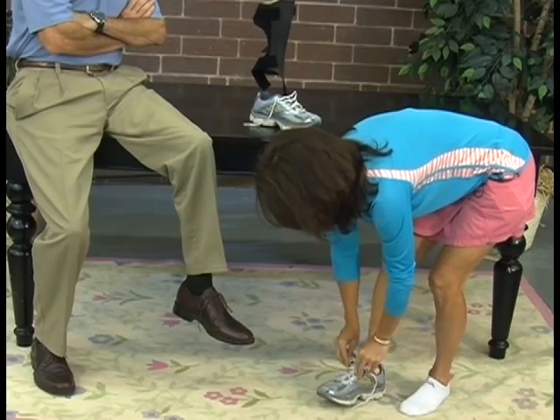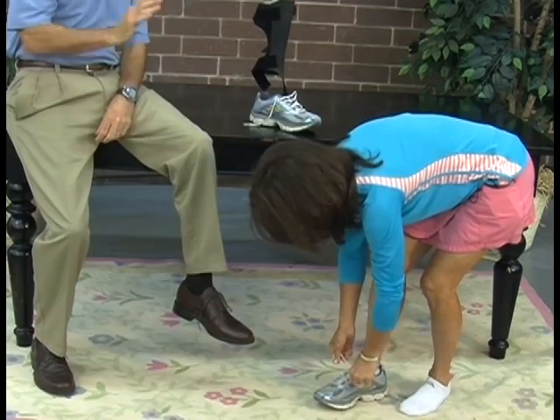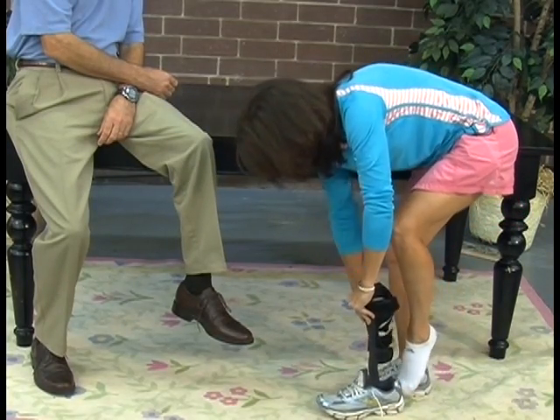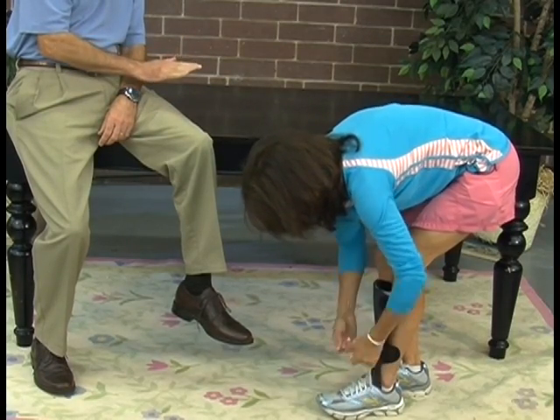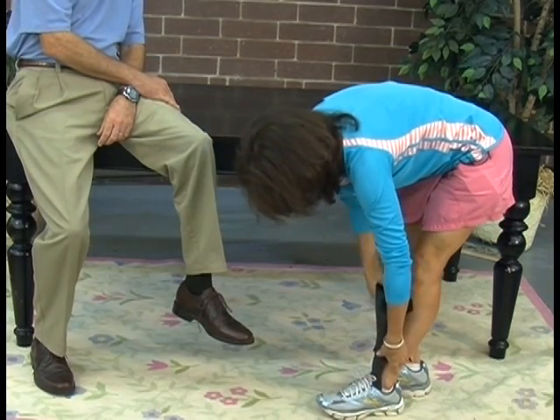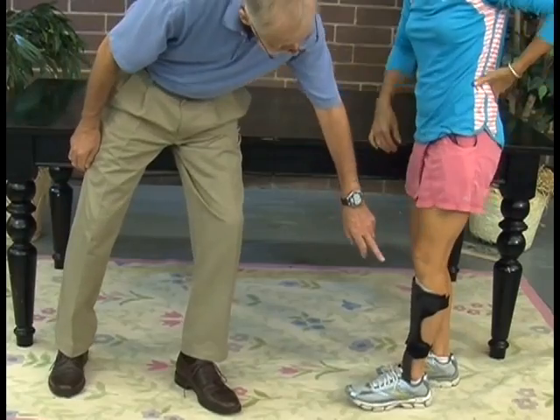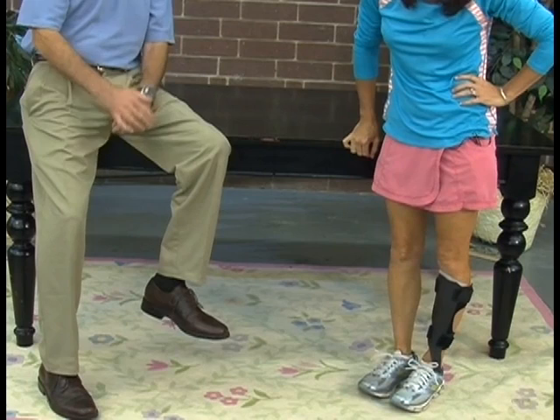When she fits the shoe, the orthotic goes in easily on the side that's not the brace side — that's not any different than putting on your regular shoe. On the brace side, she needs to make sure the laces are loose enough so that she can get her foot into place, slide in so the heel is firm and in a neutral position, and then once she has the shoe laced, she'll adjust the velcro straps so it feels snug. She doesn't want it overly tight, and you'll notice she uses a little bit of padding in this area so as not to get pressure on the actual brace, which is another way we can customize the braces.